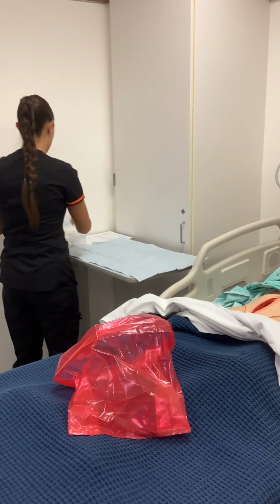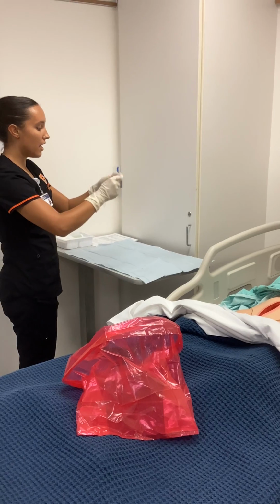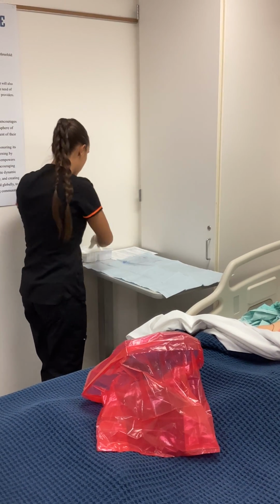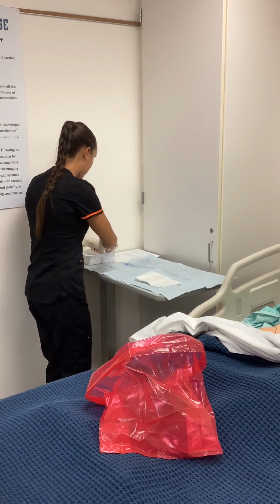I'm gonna continue to pull everything out. We have this measuring supply that we can use if we need to measure it. We have everything that we need in here.